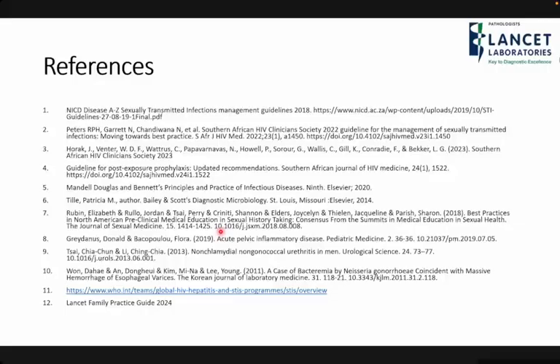We can't give you the sensitivities, but you have to do them because otherwise we will miss chlamydia with cultures. Even if we don't grow anything, whether it's because of gonorrhoea or chlamydia, there's no culture that we can do to detect chlamydia. That's why you do need a molecular assay. Other things like Ureaplasma urealyticum and Mycoplasma genitalium, we can't culture them as well. You need a molecular assay.